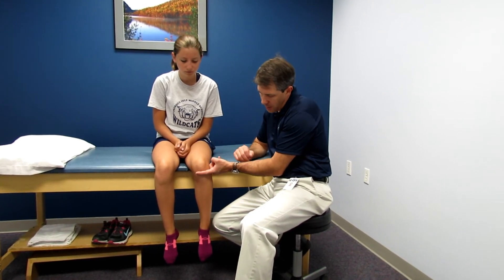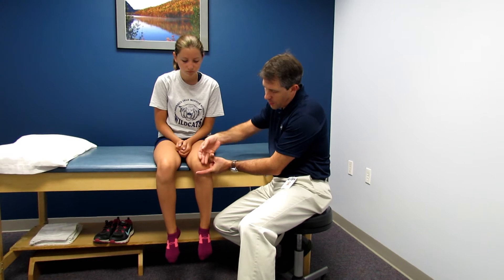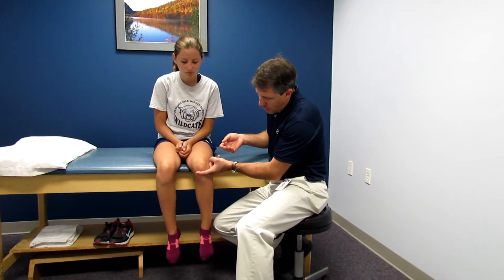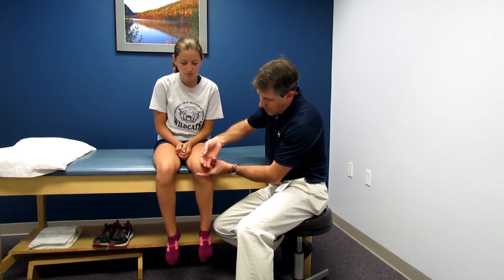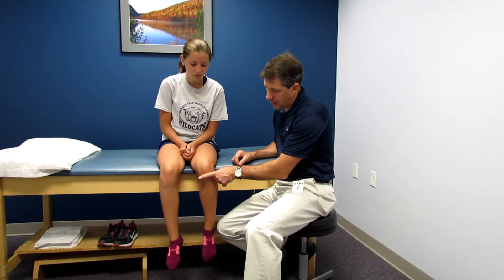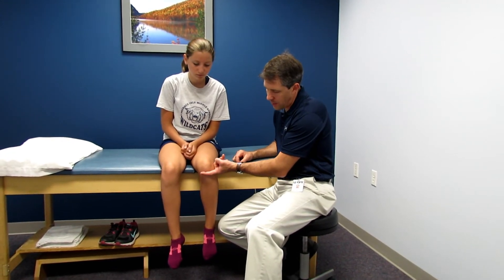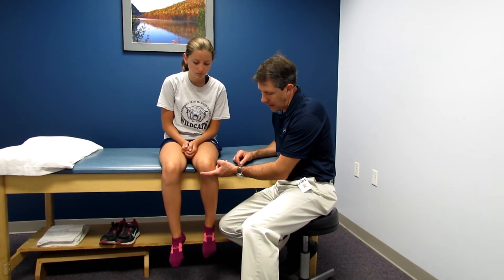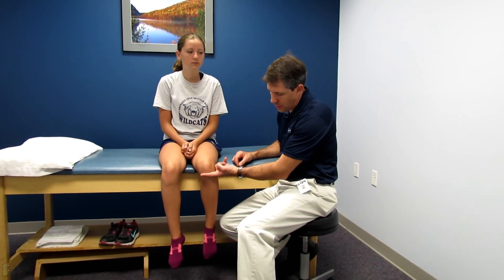In a situation like Hattie's, what I might tend to do is something that has a counterpressure piece right here, so that the pressure is absorbed through the silicone piece or strap rather than through the tibial tubercle — just like you would with a tennis elbow strap, just proximal to that area. Something that would give her a little bit of pressure could help offload this, like a Chilpat strap or even a lateral J brace.